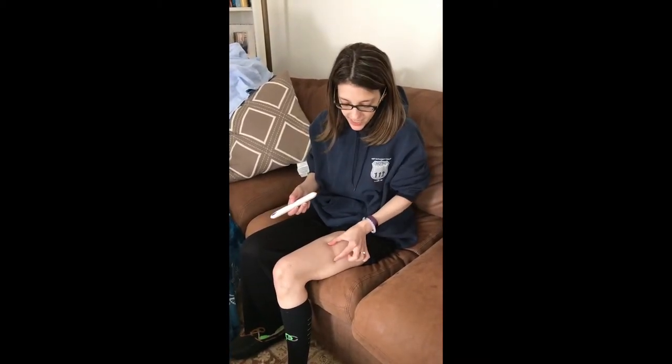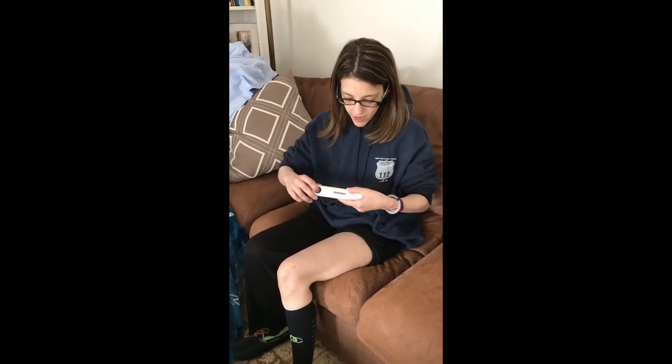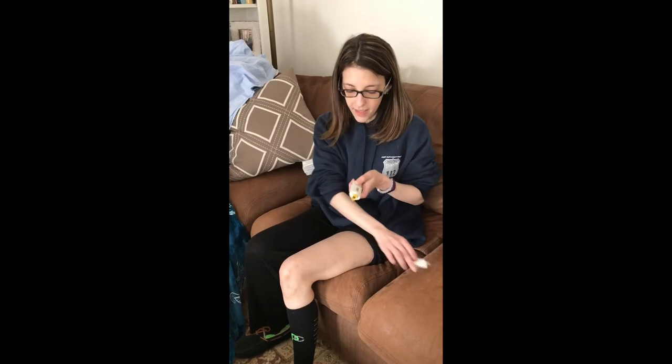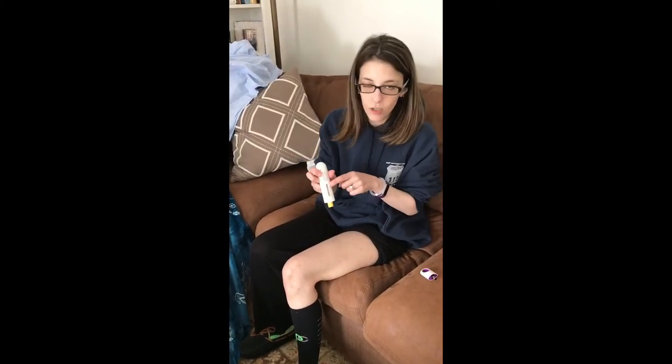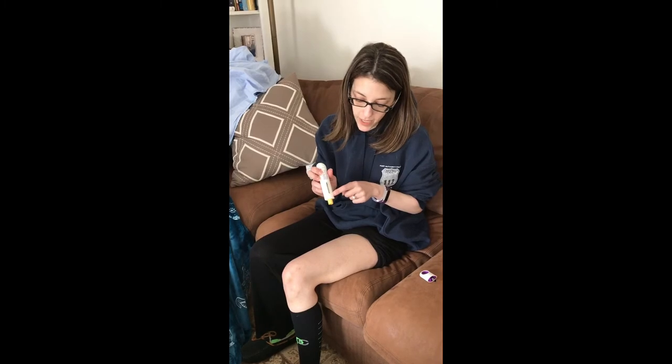I didn't know if you should pinch the skin or anything like that. Some people were saying to pinch. I did pinch the last time, but when I was looking online it said maybe it'd tighten the skin just so that it goes in easier. But don't take this off until you're ready to go — the needle's in here. You want to watch in here; it's going to click once. And after the second click, keep it until the purple goes all the way down, because the second click doesn't mean that it's done.